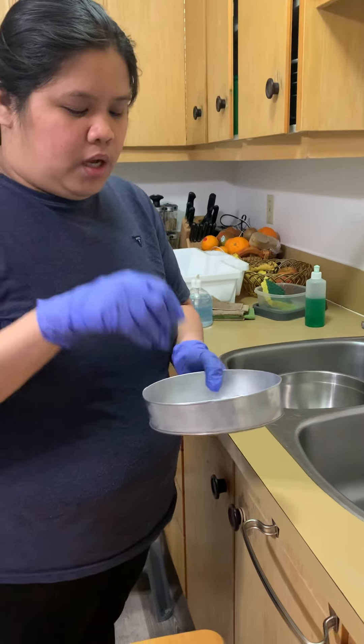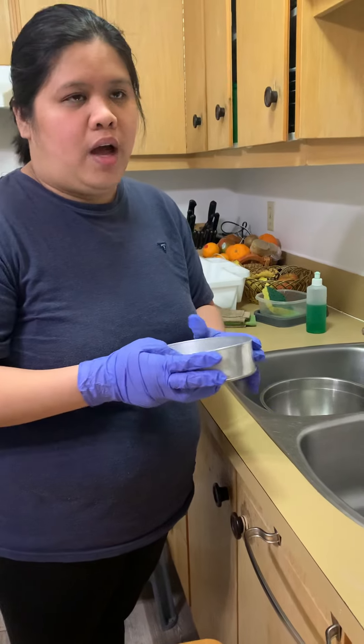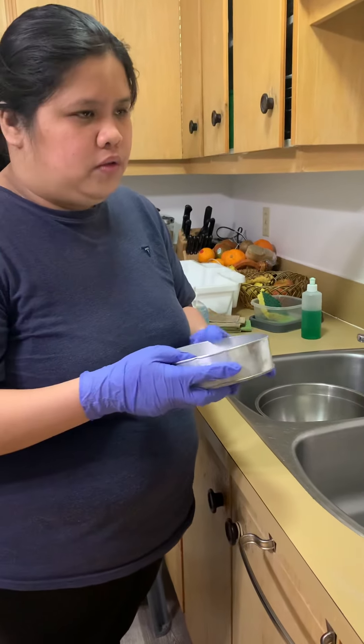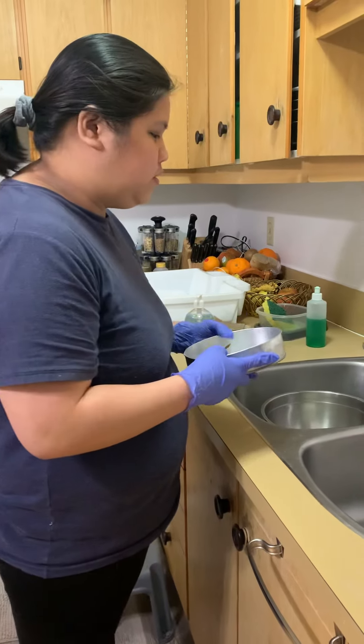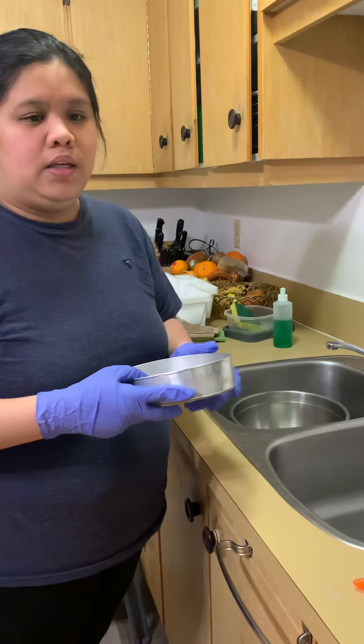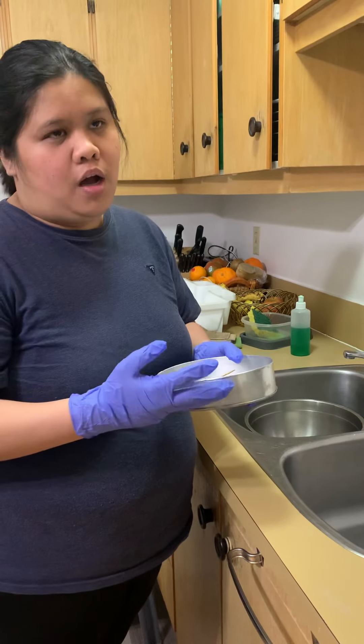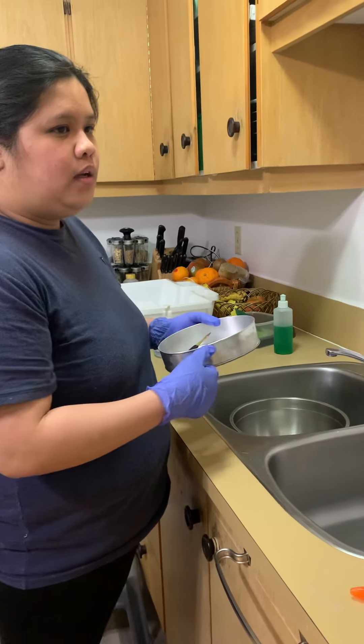First, before disinfecting, you have to do the sanitization. How do you actually do the sanitization? You need to actually clean it physically using a brush and cleaning solution.